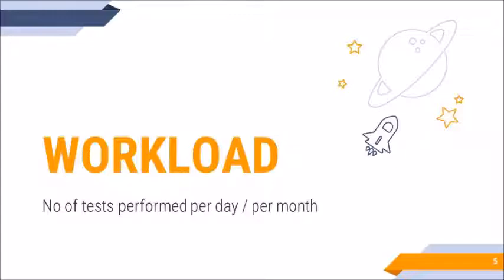The second most important condition is the workload. The number of tests performed per day or per month is important to be taken into consideration when you are planning to go for a blood gas analyzer. The workload helps you determine the cost per test. If you have a heavier workload, you will have a lower cost per test. But if you have a lower workload, the cost per test will be on the higher side. But the final decision should be made depending on the utility and the need of the specialty of the healthcare institute or the hospital.